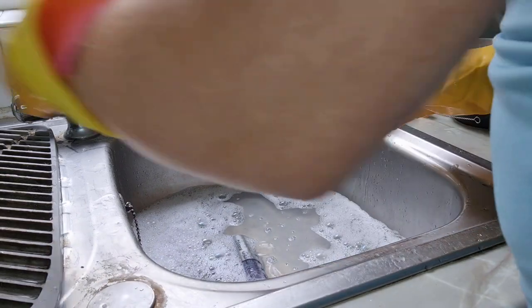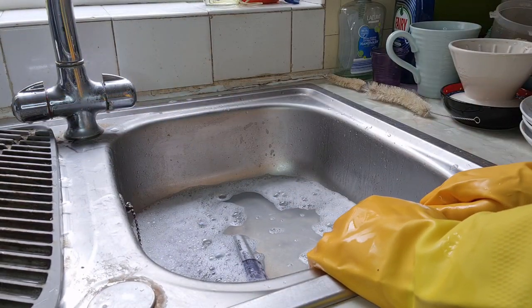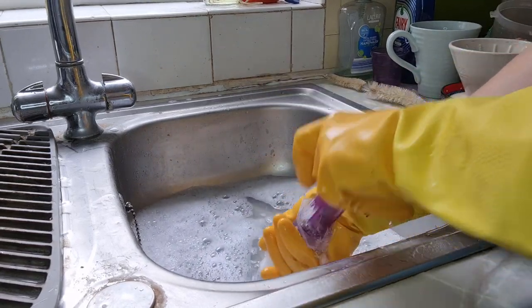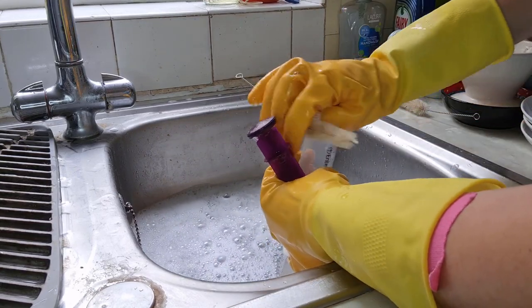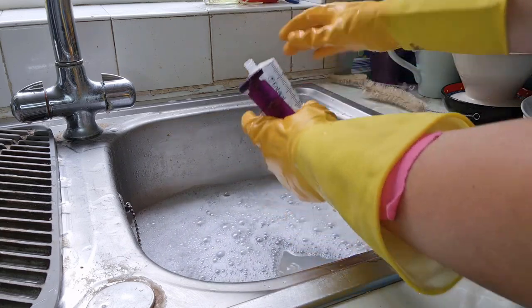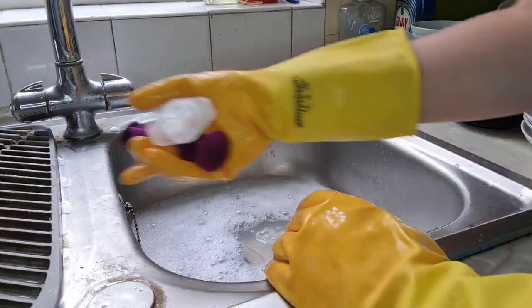While I'm here, I'm going to give you some bonus syringe cleaning as well. After you've sucked and pushed through the tube, you can go in with a tiny brush, clean the threads, clean the top, rinse it off and put it to dry.